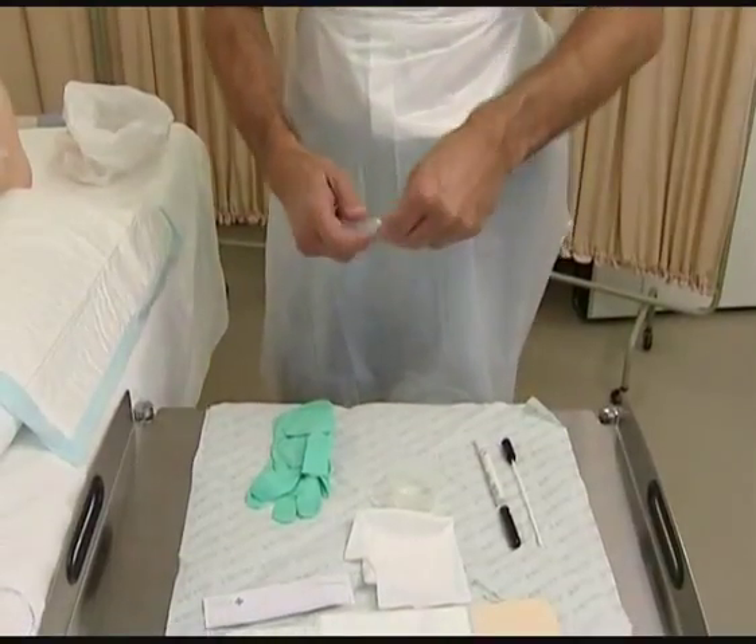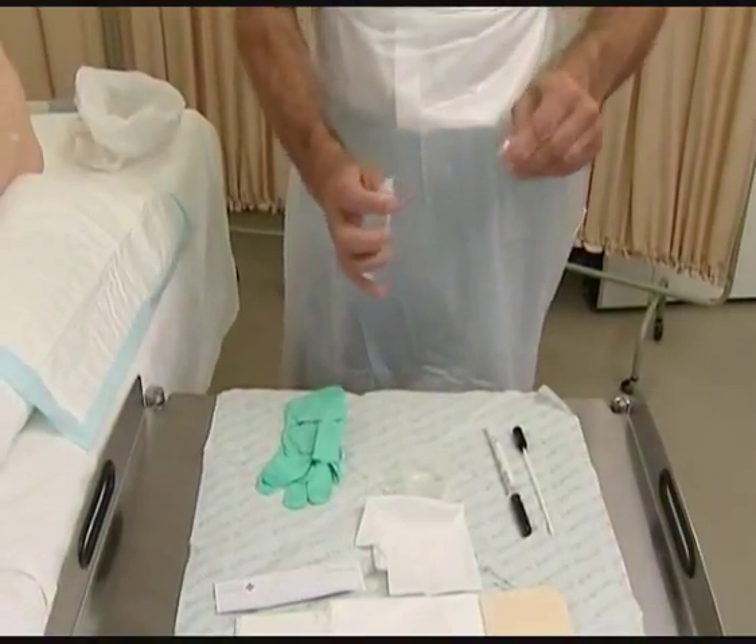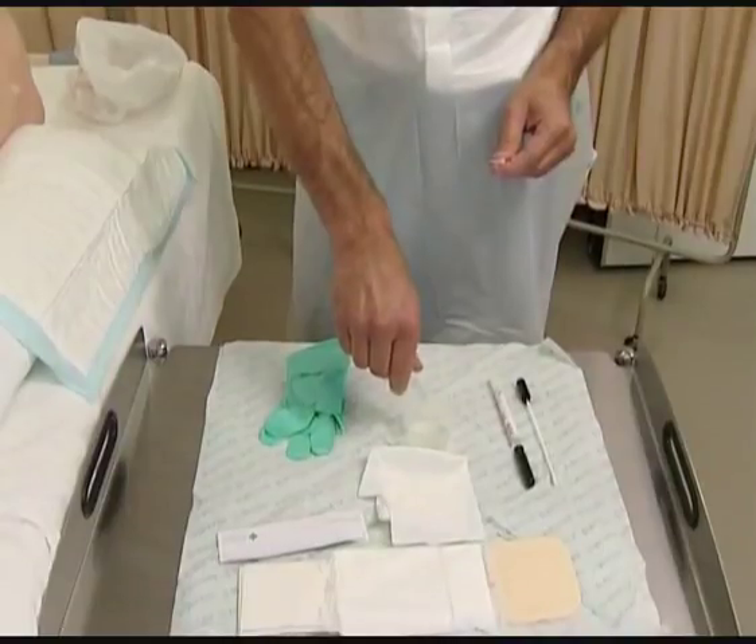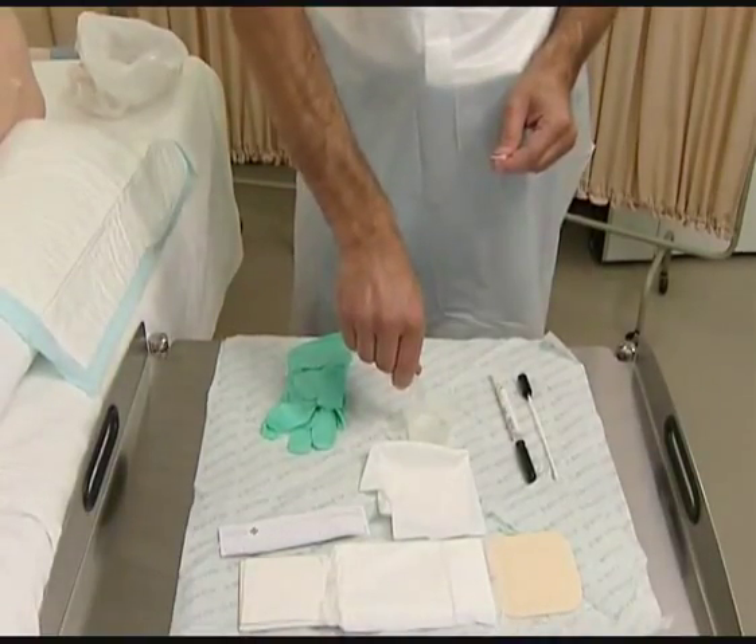If a cleaning fluid is required, fill your container with that fluid, disinfecting the sachet tear strip or ampoule twist prior to opening.